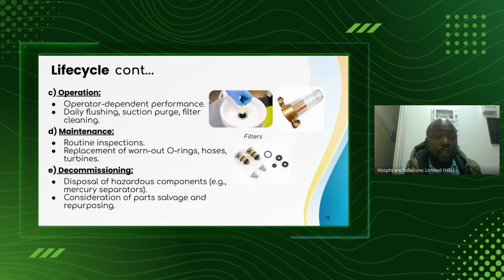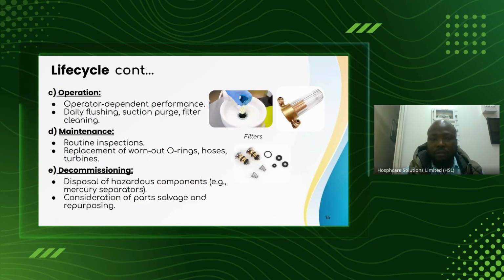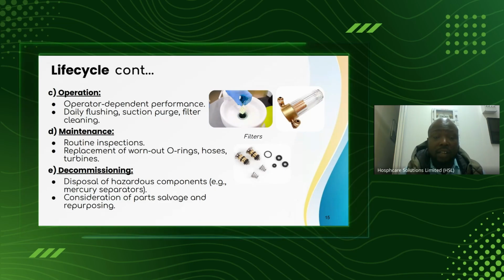At what point are you supposed to decommission the machine? Once the machine is unsafe for use, or any part is unsafe for the patient and the user, that machine needs to be considered non-operational. You need to decommission that machine.